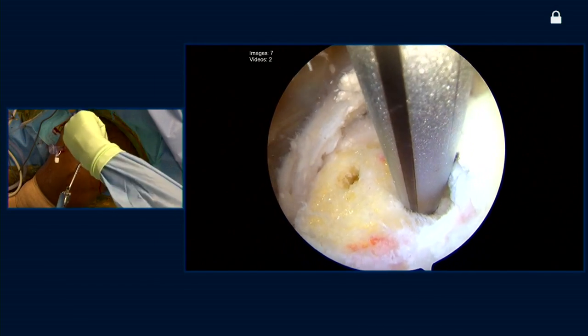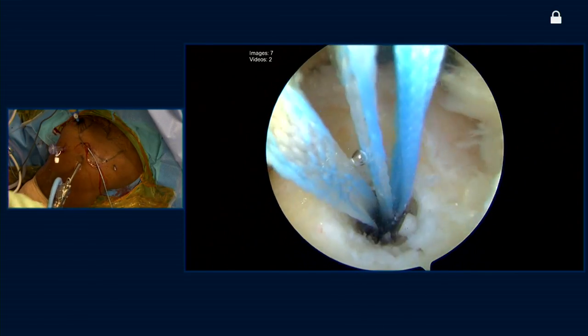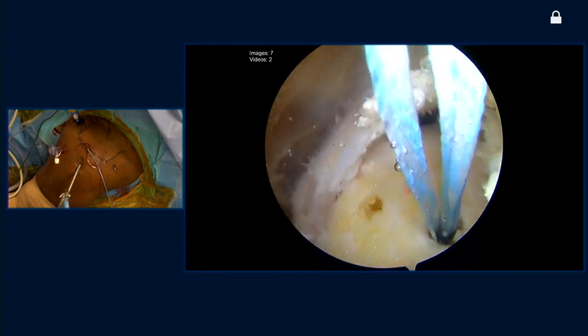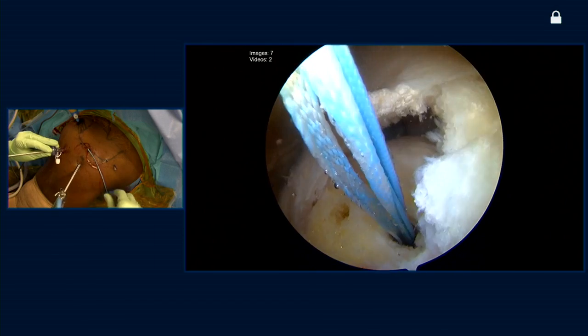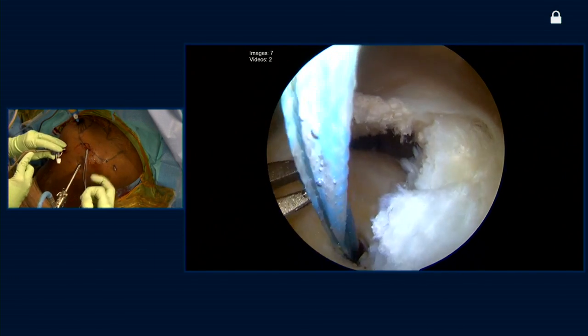In this case, we're using a 5.5 millimeter helicoil anchor. You can see that it's got this open architecture platform — the center of the anchor is hollow to allow some egress of marrow elements. In this case, the anchor is loaded with a tape and a suture. What we're going to do is unload one of the sutures and load it up free to use as our cinch stitch.